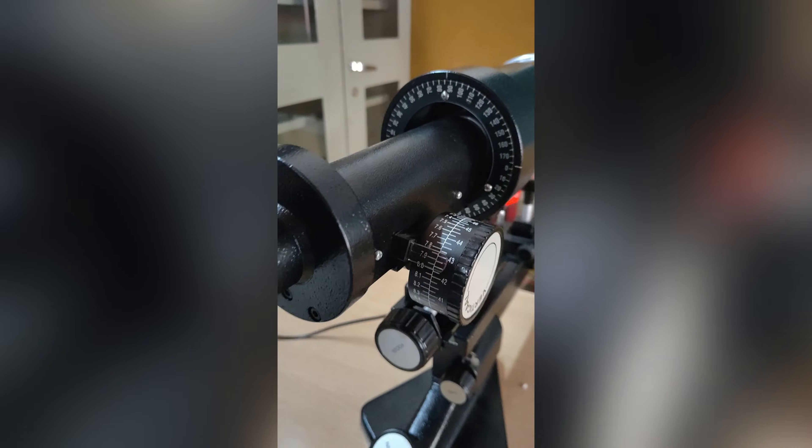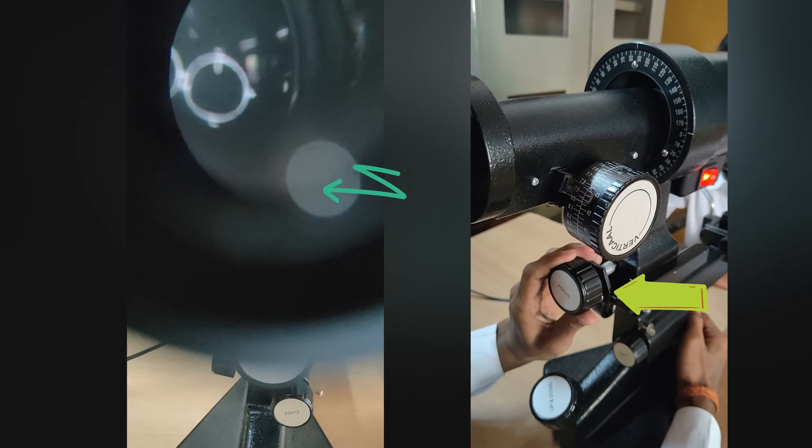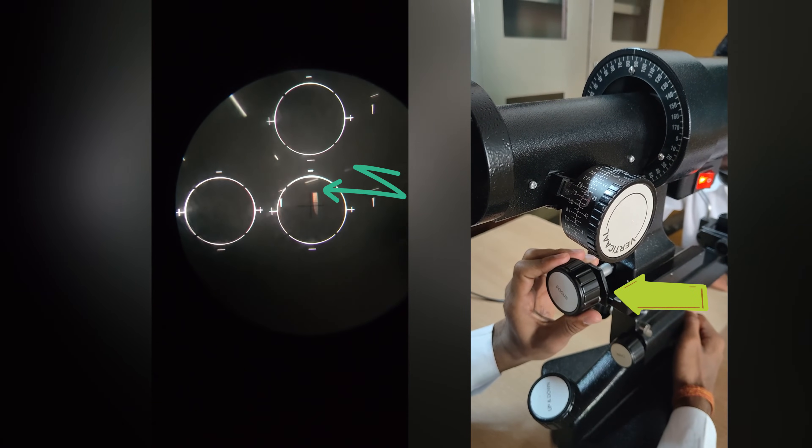Looking through the eyepiece, first focus on the mire to get a clear view. Use the focusing knob to make sure that central mire is single. Once mires are focused, adjust the keratometer such that the reticle is in the center of lower right circle.